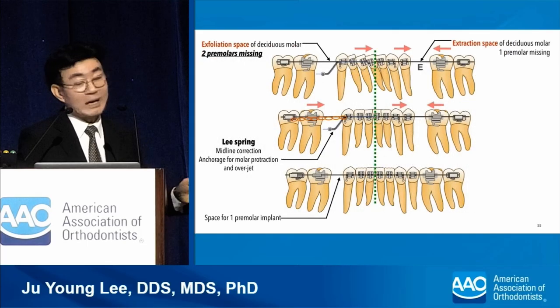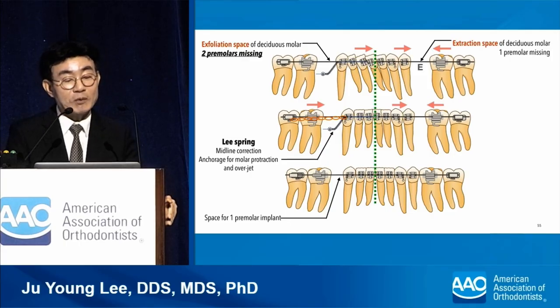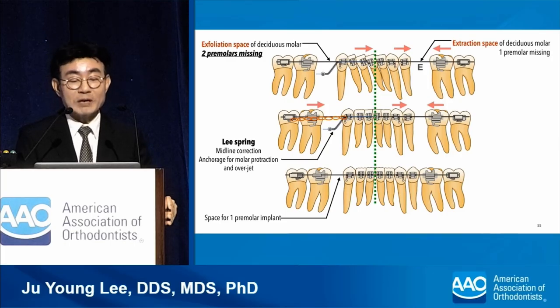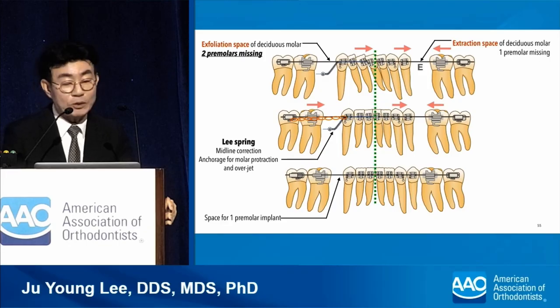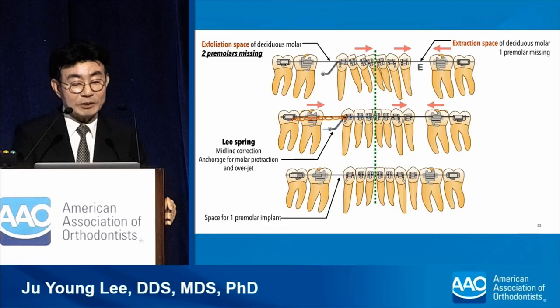So the mandibular anterior teeth shifted to the right side. On the left side, moving the posterior teeth into the extraction space of the primary molars could close the premolar missing space and improve the position of the anterior teeth at the same time. On the right side, the canine had to move mesially while moving the posterior teeth in the same direction.